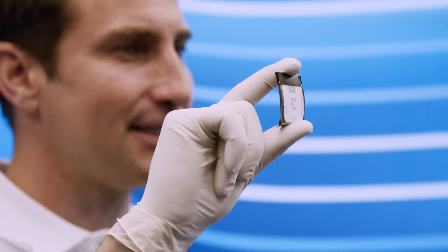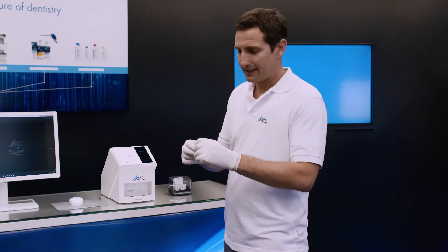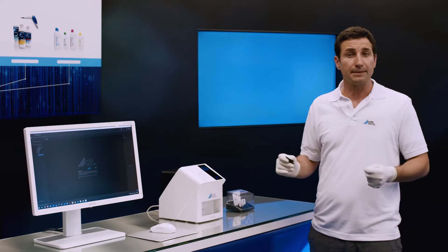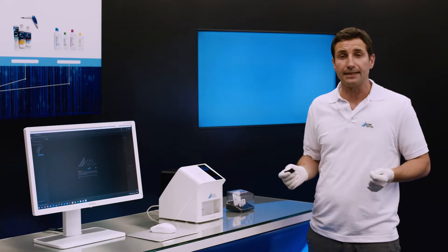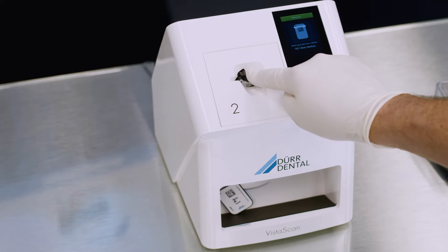Throughout the entire workflow, the original light protection covers from Dürr Dental effectively prevent image information on the image plate from being erased due to exposure to ambient light. In addition, they also offer effective protection against cross-contamination. The light protection cover is very easy to open. Combined with the feeding concept of the VistaScan MiniEasy 2.0, protection from ambient light is ensured.